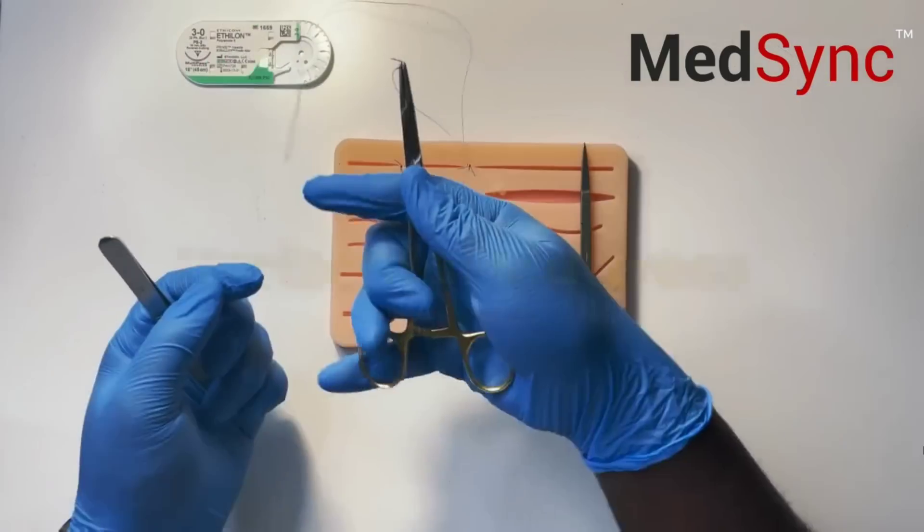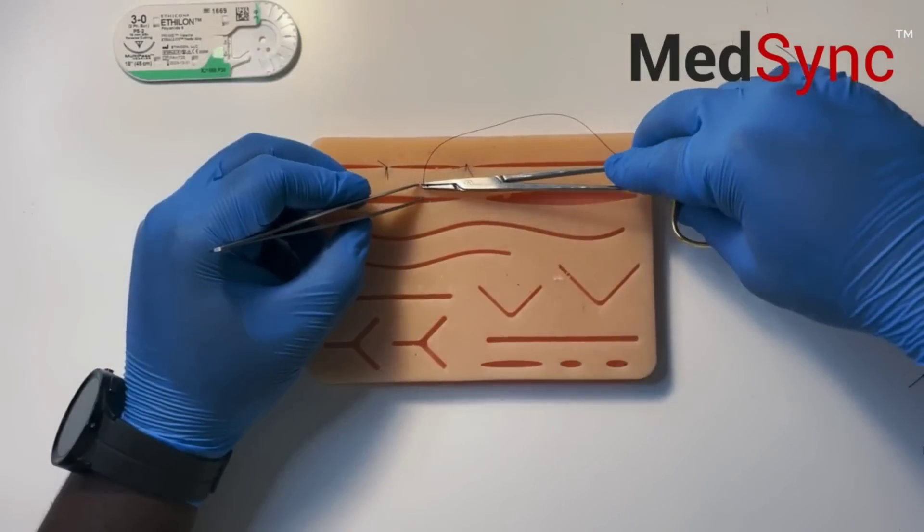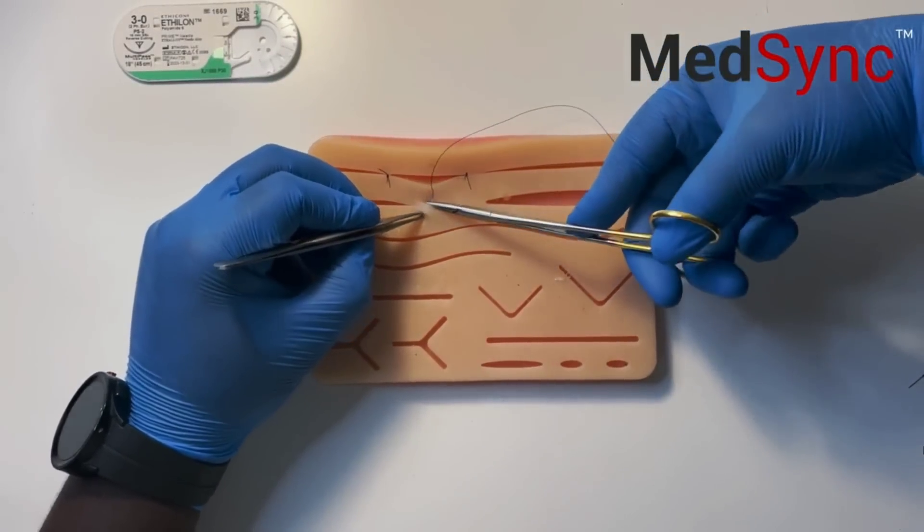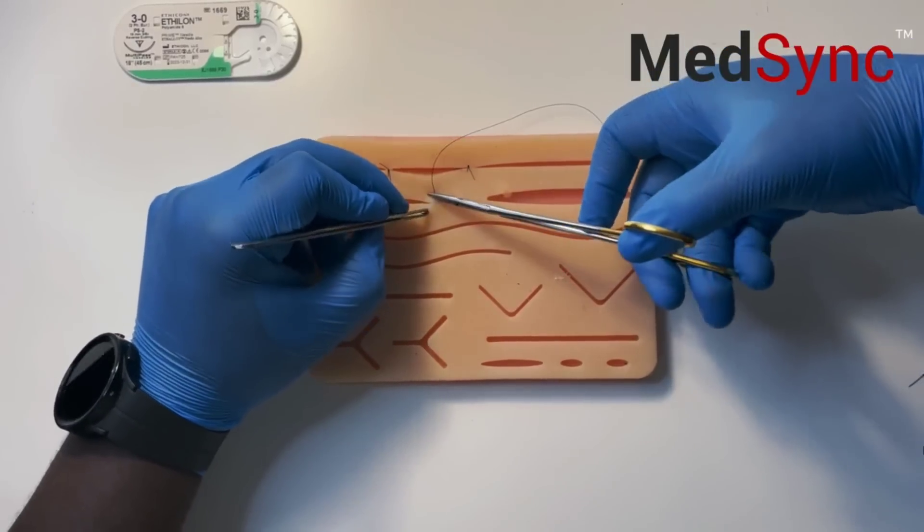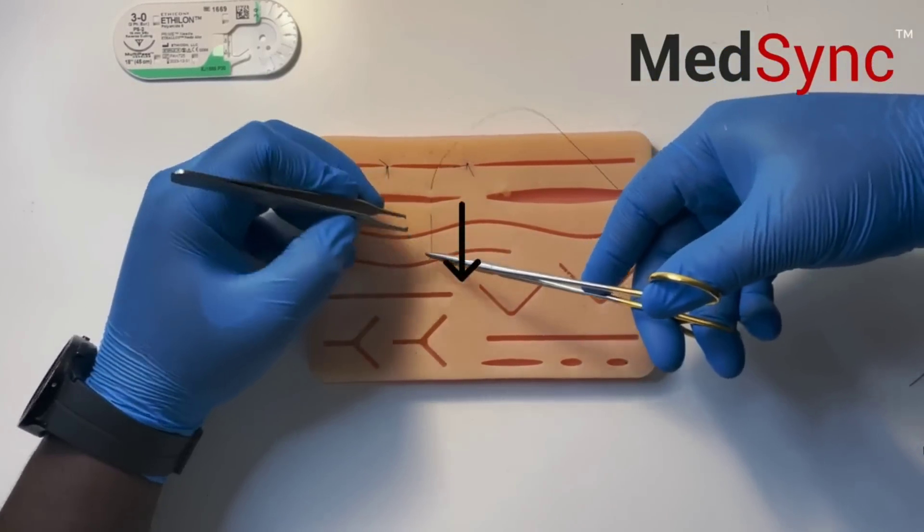The horizontal mattress. My fingers are mounted within the needle holder. I rotate my wrist. I grab the needle straight away. I pull the suture through.